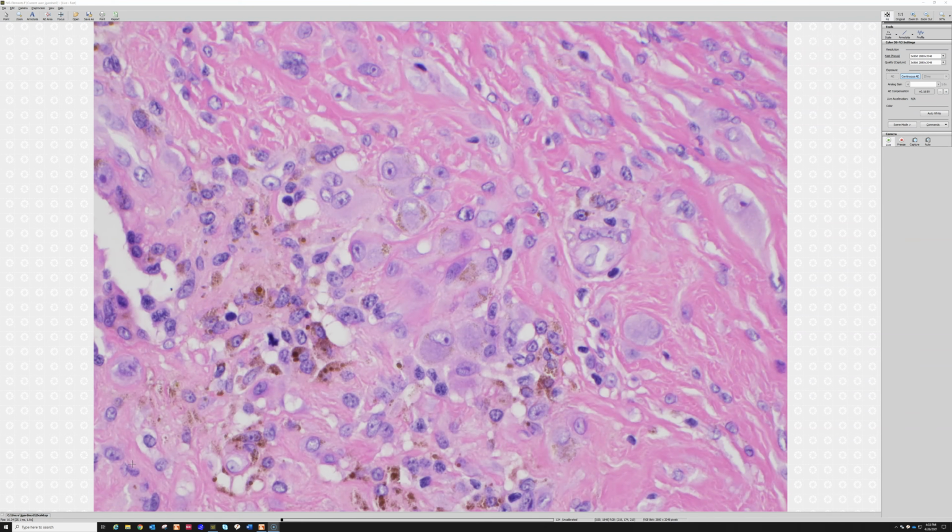So this is a tenosynovial giant cell tumor. And it could either be giant cell tumor of tendon sheath, which is tenosynovial giant cell tumor, localized type, or, and we've seen already from low power, this is a circumscribed localized lesion. So that's certainly what this is going to be. And it's also in the finger, which is a good location for that.